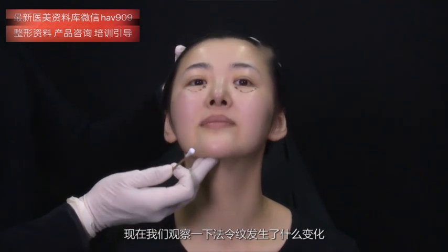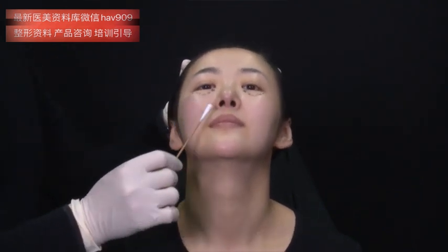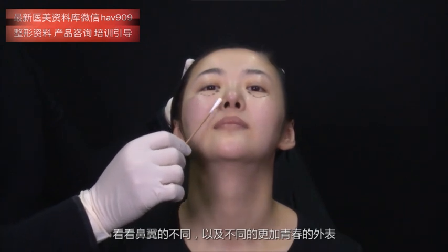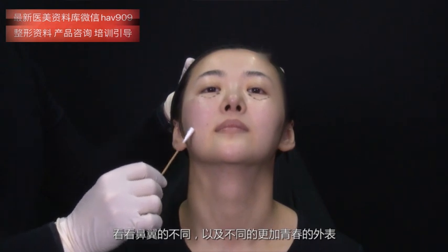Now let's observe what has happened to the nasolabial fold. Take a look at the difference in the nasal flare. Also take a look at the difference of a younger appearance. Now smile and we notice the change.